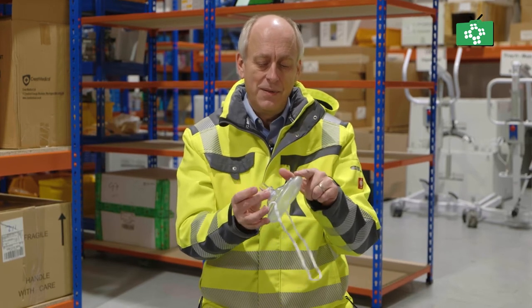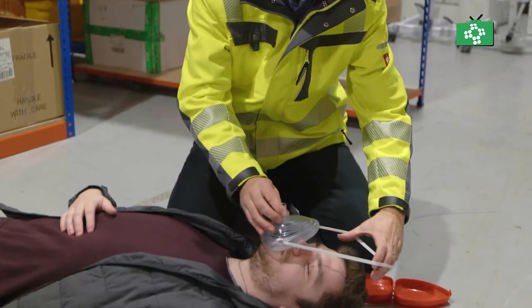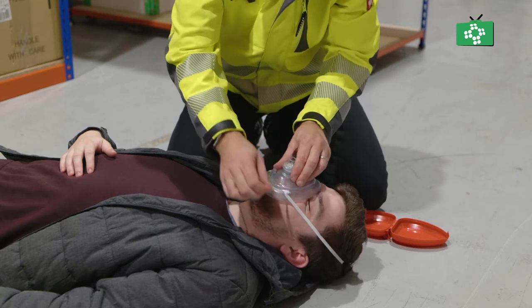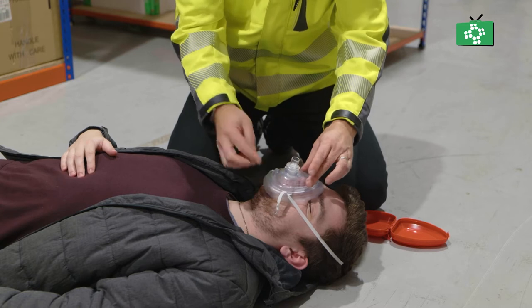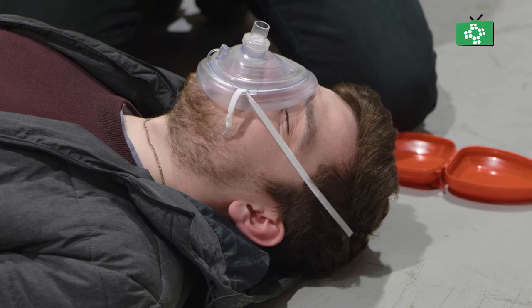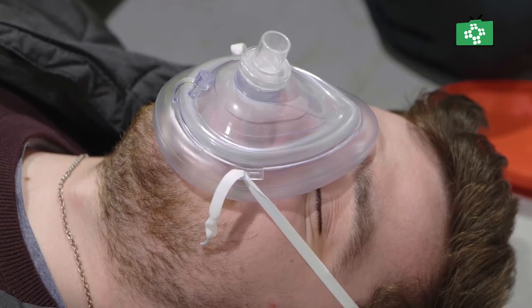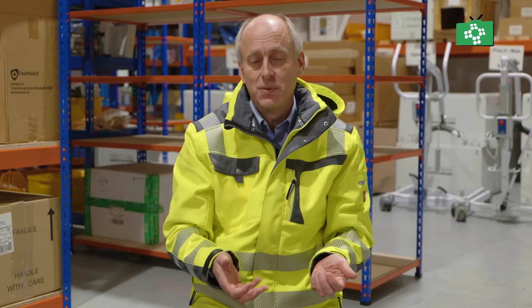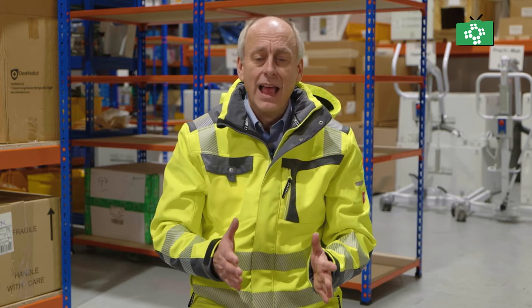To apply the mask over someone, locate where the nose is so it's going over the nose just over there. The elastic can just go around behind the head and you can pull it tight by pulling these bits here — they're usually gripped in so they stay in position without having to tie knots. Then if you're doing rescue breaths you can open up the airway and do your breath straight in. The advantage that way is you're opening up the airway and blowing into the mouth and the nose, so you don't need to squeeze the nose because you've got maximum attempt to get the air in.